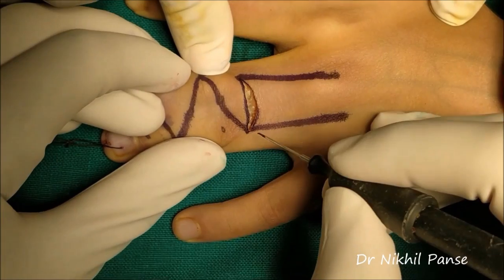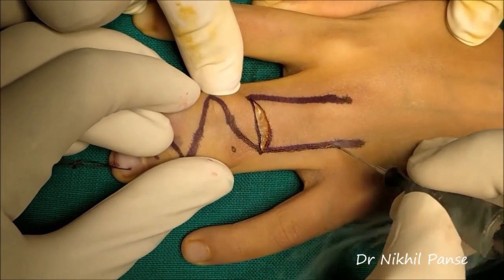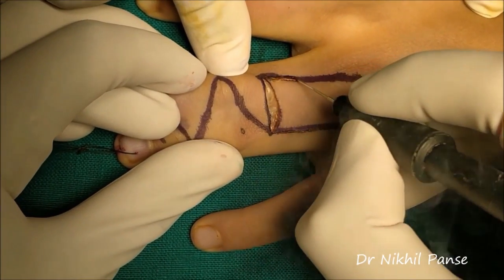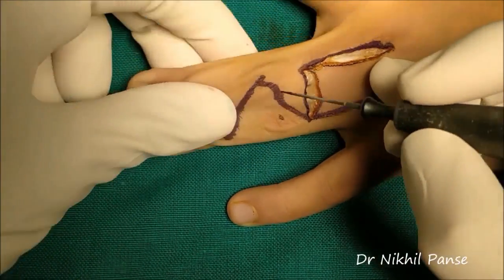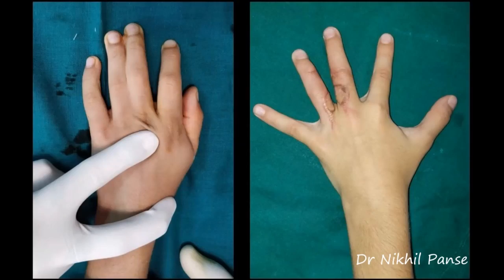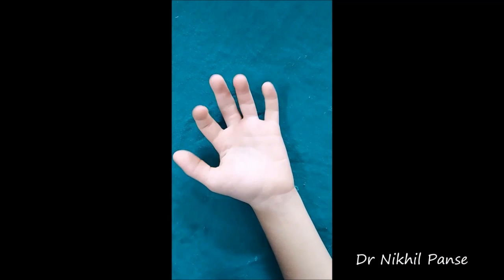Now we begin by elevating the flaps over our markings. Post-op scar care and massage are initiated.